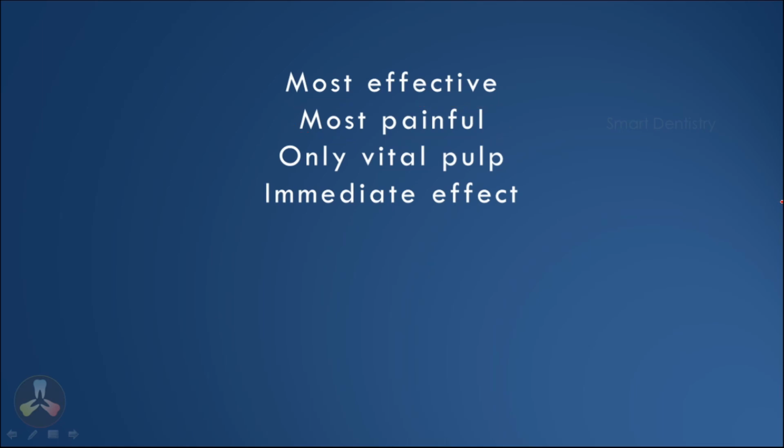We should always inform the patient that this procedure can be painful, but it will last for less than 2 or 3 seconds. This will work only in case of a vital pulp. If you have diagnosed the tooth to be non-vital, do not attempt giving intrapulpal anesthesia. Only 1 or 2 drops of local anesthetic is enough to anesthetize the pulp. And if the technique is improper and you are not getting a good resistance while giving the injection, this technique will not work.